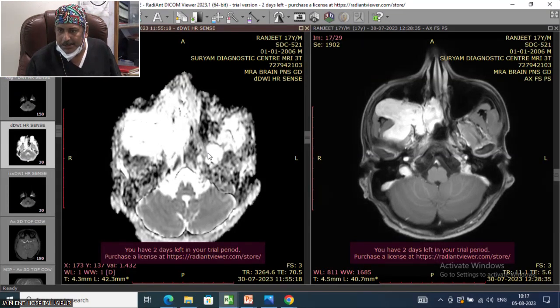Just a couple of days back, we were referred a patient with the same nasal mass, a child, for angiofibroma. We got the MRI, showing huge diffusion restriction. We took a biopsy, and it turned out to be rhabdomyosarcoma. So, diffusion alone can differentiate and identify the malignancy more than 98% of the time. On the basis of diffusion, we can preempt the diagnosis of malignancy.